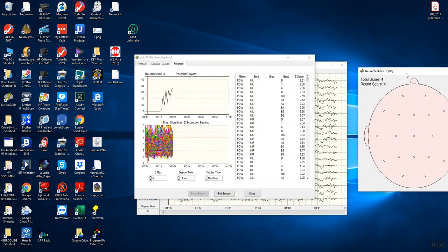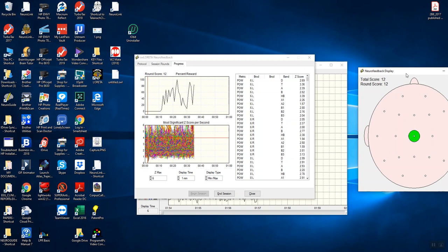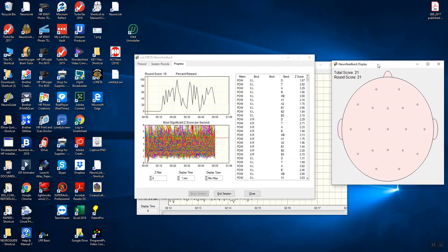And so what we've done is started with the patient's symptoms, assess the patient's symptoms using NeuroGuide and particularly the NeuroNavigator. Then we imported the severity of the patient's symptoms and the networks that are most deviant from normal into NeuroGuide. And then we begin our neurofeedback, targeting the hubs and connections which are linked to the symptoms and are most deviant from normal. The goal is to reinforce greater stability and efficiency in the patient networks that are related to the patient's symptoms. So that's how NeuroLink works.